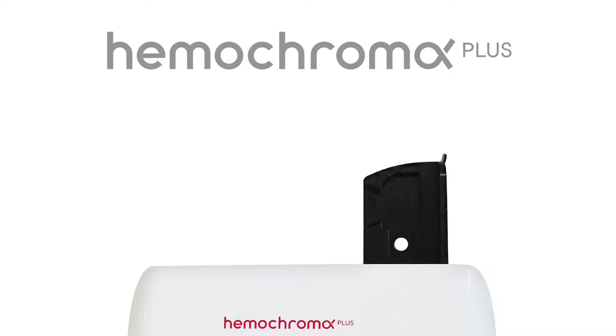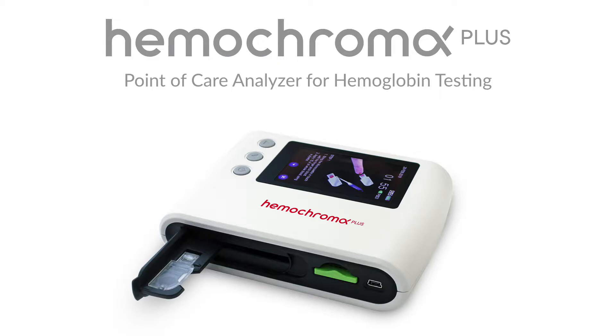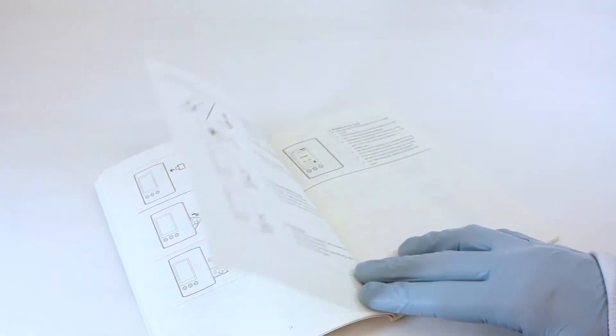Welcome to the Hemochroma Plus Analyzer Instruction Video. This training video will show you how to use the Hemochroma Plus Analyzer, a point-of-care analyzer for hemoglobin testing. Refer to the user manual and test product insert for additional information before testing for the first time.